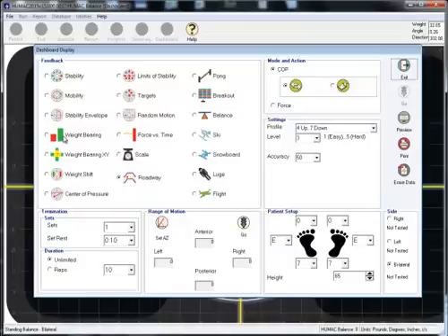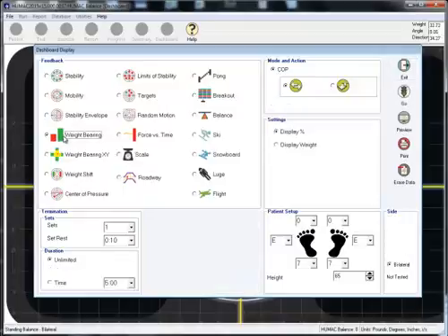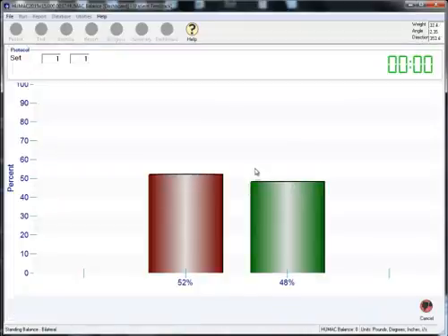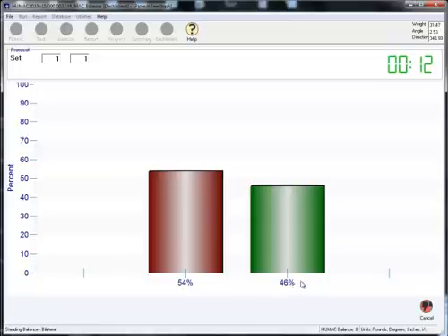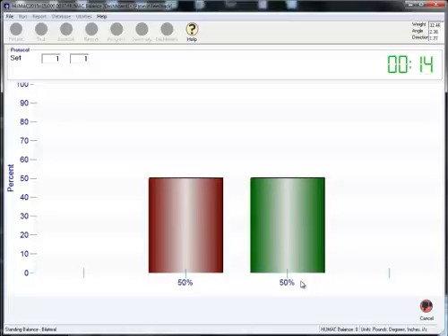Select Weight Bearing. Select Go. This display shows how the patient is distributing their weight. For example, 54% of my weight is on my left side and 46% of my weight is on my right side. So what you might say is shift your weight a little to the right so that your weight is evenly distributed on the bar.